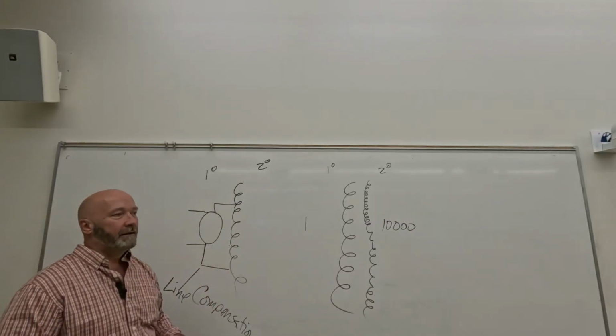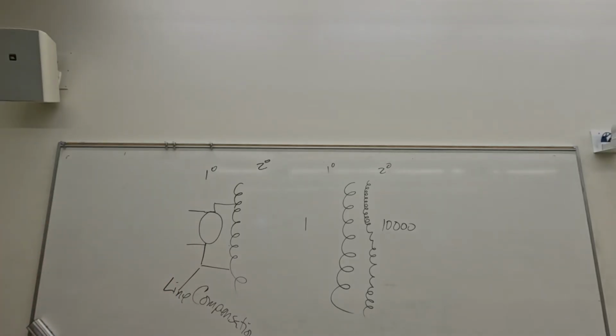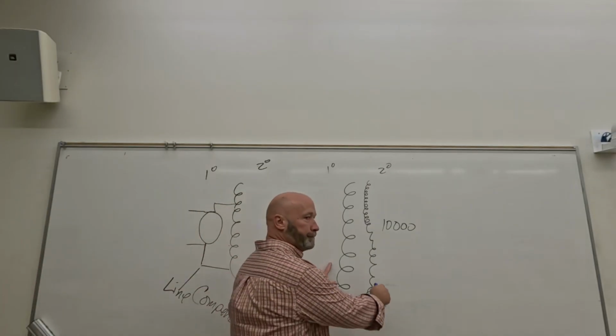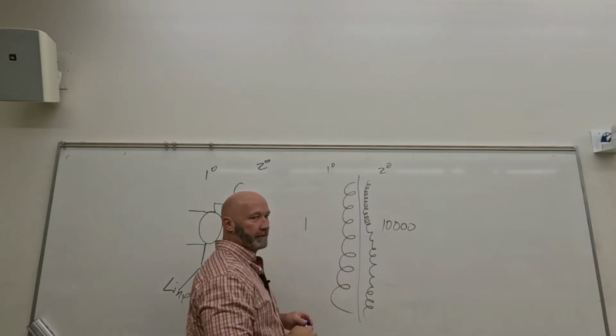So the circuit is going to be divided. If you look at the back of the chapter, I'm going to split with Bushong in his description of the circuit a little bit. Usually I try to stick with test questions that would reflect what Bushong says. But for simplicity's sake, you see where he's showing the high voltage section? High voltage section incorporates both of these, right? I'm going to split the circuit right there instead of right there, okay?